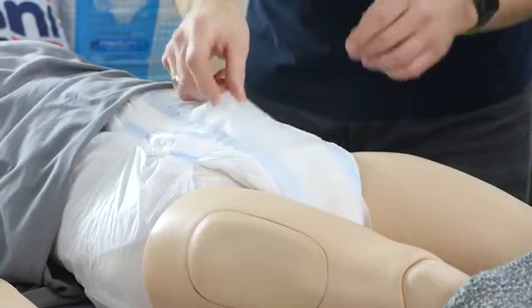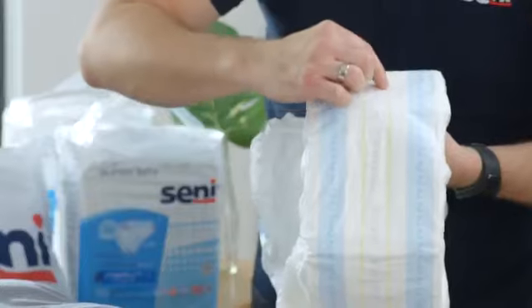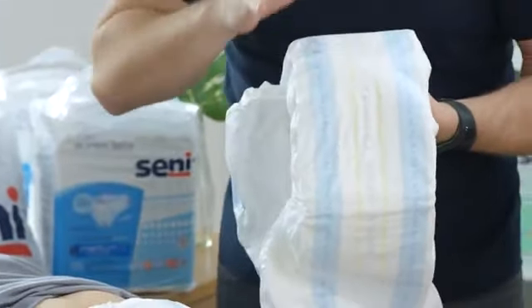Traditional adult diapers will be a perfect solution for people with urinary incontinence and lying position. These are products that are fully covered with a breathable laminate, thanks to which the skin remains safe. The moisture is drained from the skin outside the product. In addition, these products have a special EDS distribution layer, which will perfectly distribute moisture throughout the entire surface of the product. Thanks to this, we use the absorbency we paid for. In addition, the product has a wetness indicator that indicates the need to change the product. It is a perfect solution both for the patient, because we change the product exactly when it is needed, but also for the caregiver, because the product is not changed too often, and of course, not too rarely.